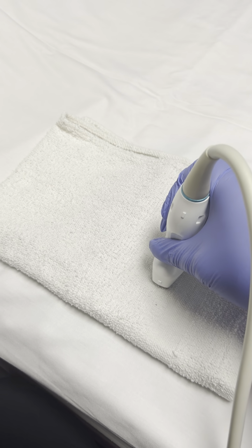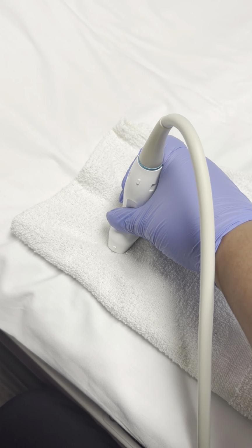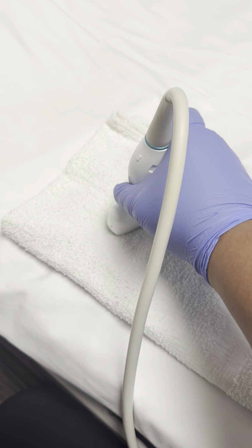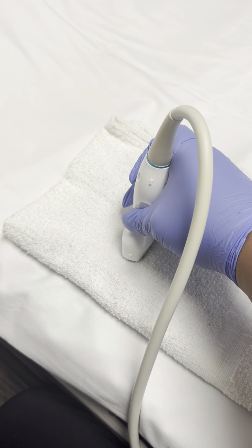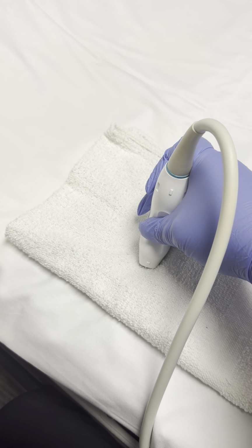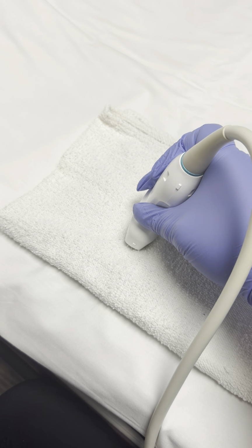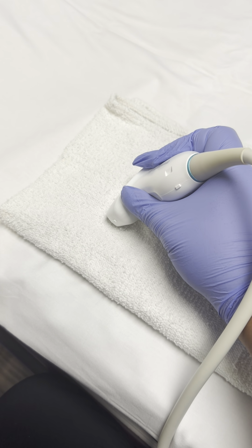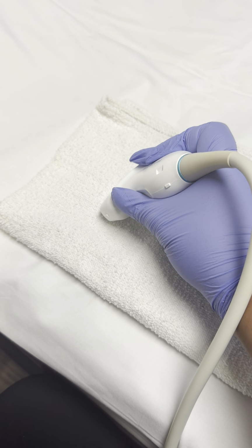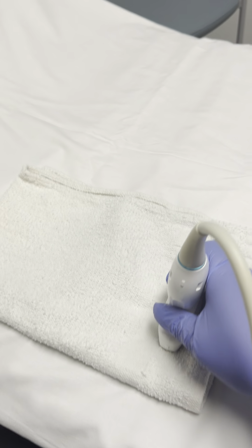Now, in the case head was up, say head's here, we're in the transverse plane, head's here, we located the heart, and then in this case, we want to sweep upward towards the standard heart sweep, and so we're going to do that by doing that. And that's sweeping. Now, as you sweep, going back down to our vertex baby.